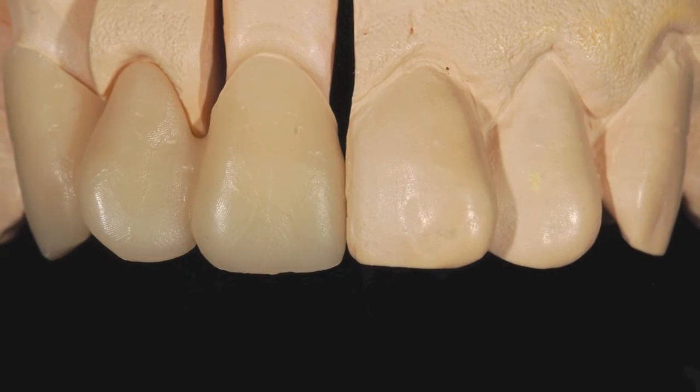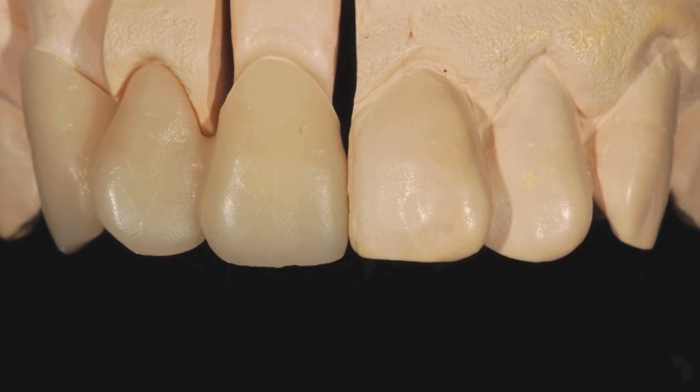The right side was scanned and mirror copied to achieve a harmonious smile design.